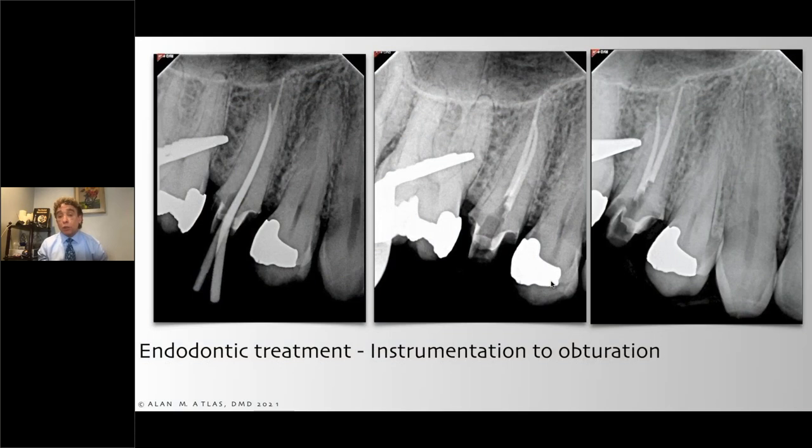If I wanted to drop a post space here, I could. I didn't need to do so, but I'll show you that it's not that difficult. It doesn't change anything I'm doing here, because after the access is done, I have the ability to drop a post space and drop the post, and I'll show you how to do that.